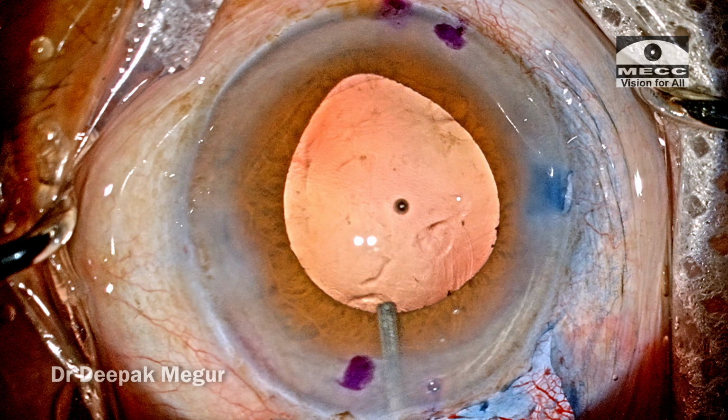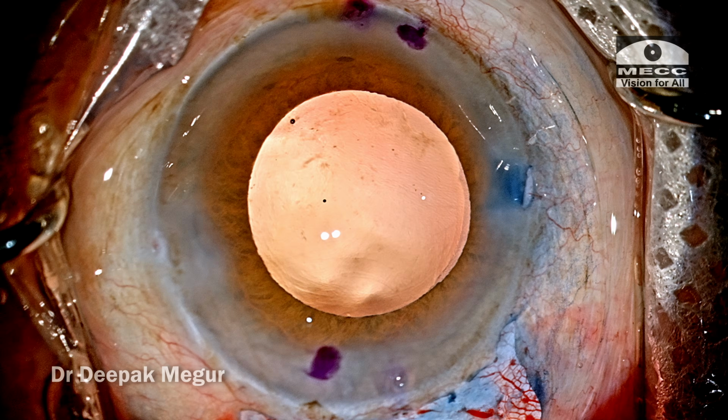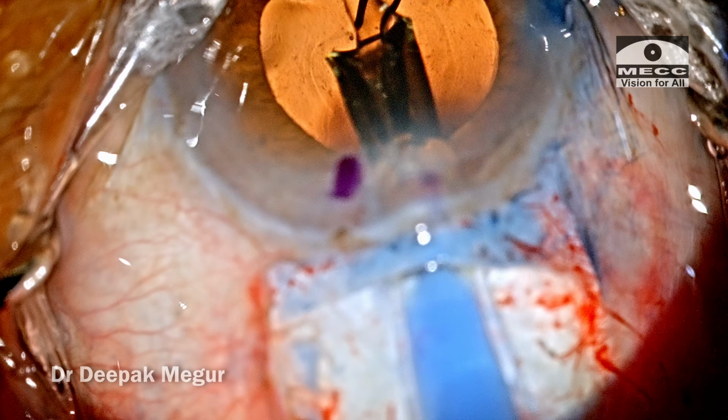Now is the time to implant the lens. The bag is filled with OVD, and in this case I'm going to use the cartridge and the injector system itself to place the lens inside. Of course, we can just insert the lens using a forceps as well.